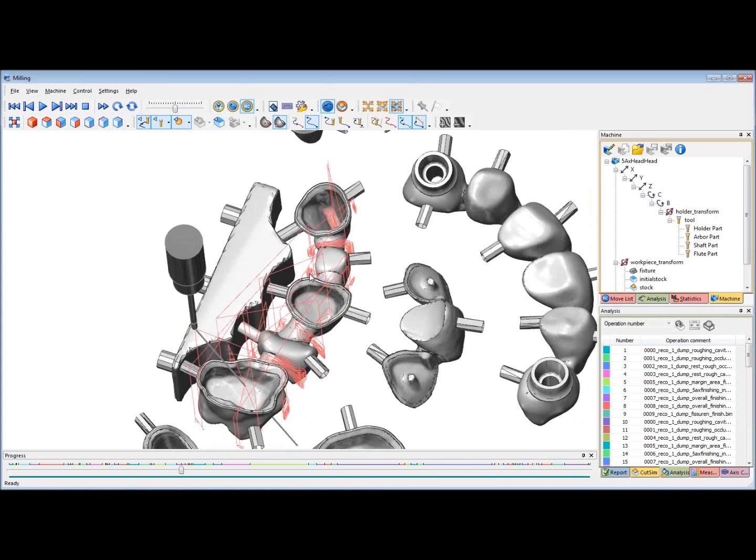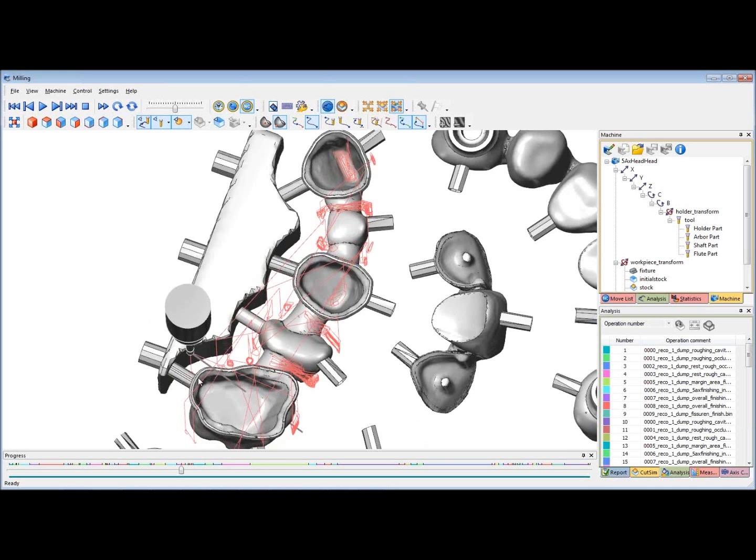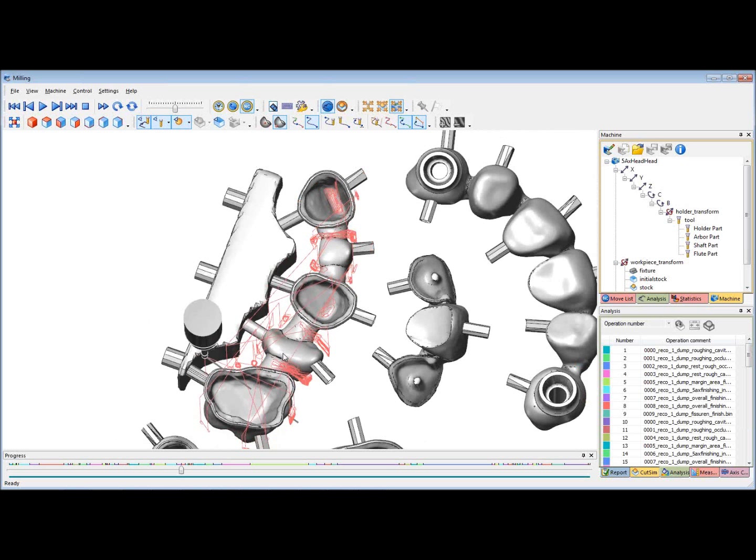We have some rest roughing operation. You can notice that we have left this indication out for the rest roughing. This is automatically left out because this coping has an insertion direction with a difference of 15 degrees. So there will be a lot of rest material remaining in the insertion direction. So we have a separate rest roughing operation automatically generated for this. This logic can be built into the templates.